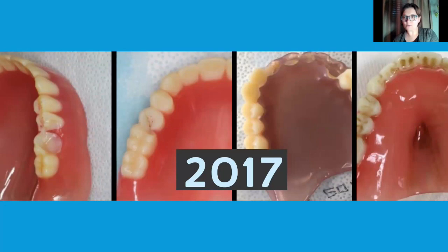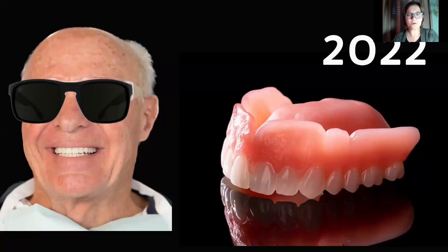And then on the right, you see this very stained denture. This was an immediate denture I made for one of my patients, and I saw her at the 24-hour recall. And this is how much stain she had accrued in that first 24 hours. So fortunately, we've worked through many of these kinks, and in just 5 short years, we've seen such vast improvement in these resins. So 2019, 2020 is when we started to see the release of the high impact resins. Those high impact resins are now in the second or third generation, depending on the company.